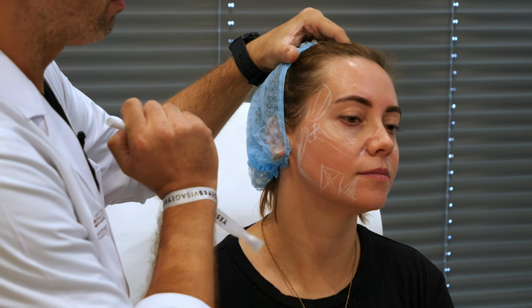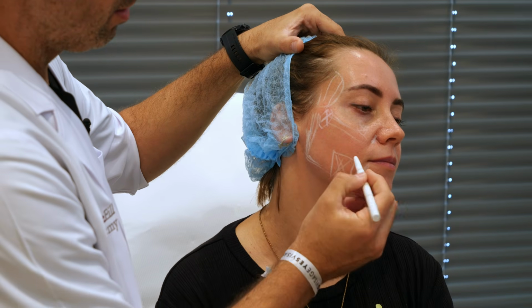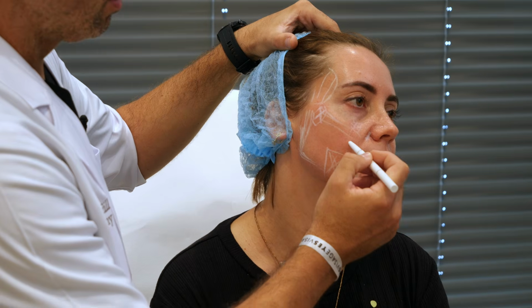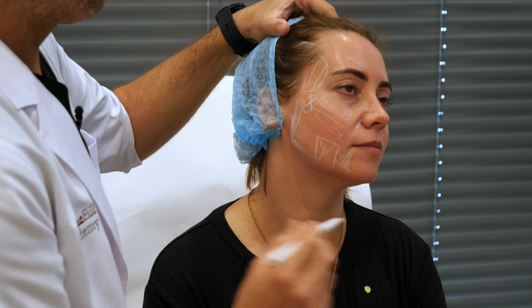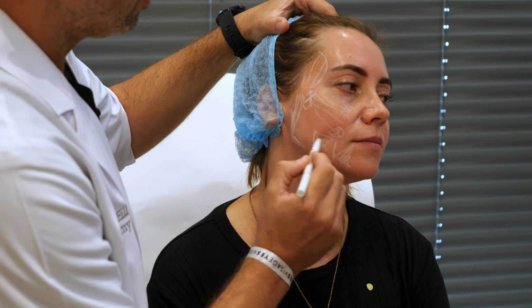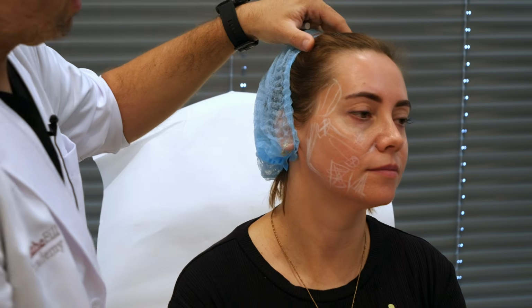One entry point. The other entry point, to reposition this volume, maybe in the vertex of the anterior malar, okay? Anterior malar, the other entry point. It's not for treatment, okay?